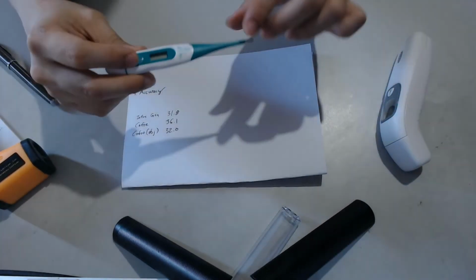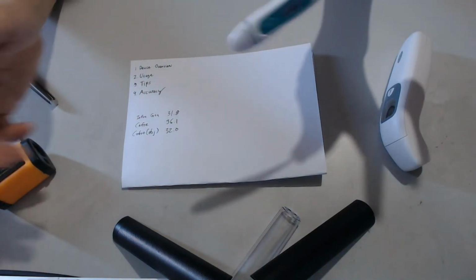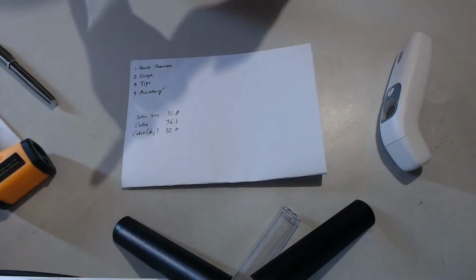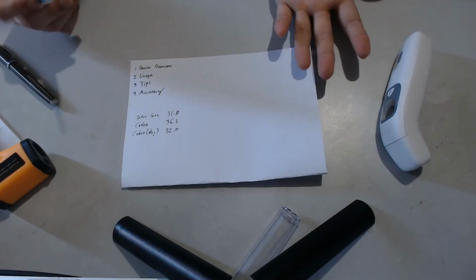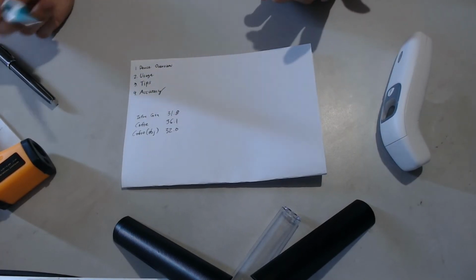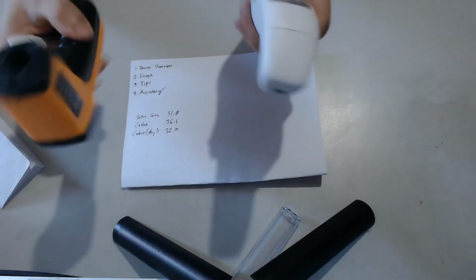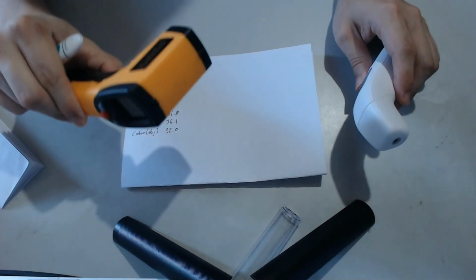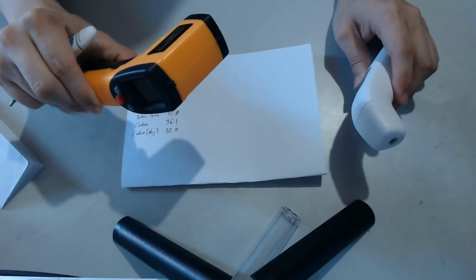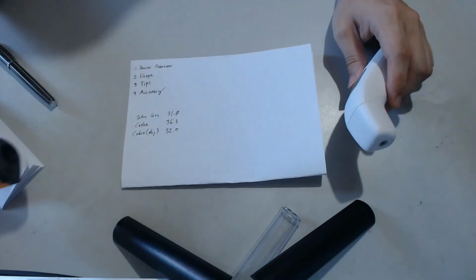So I'm going to do it two ways. One is I'm just going to hold the probe. 33.9. Okay, so it vastly differs because this is also calibrated in a different way compared to this and compared to these two. So again, it's not that this is inaccurate. It's that it's measuring the external body temperature, but what we want is the internal body temperature.